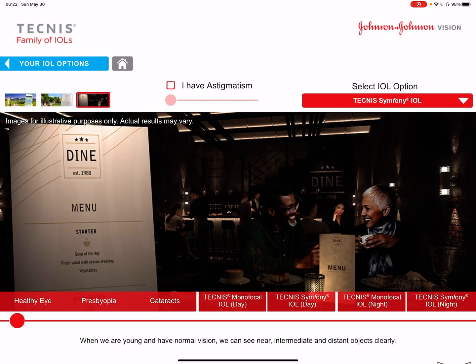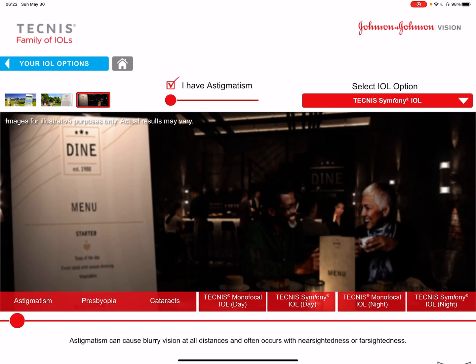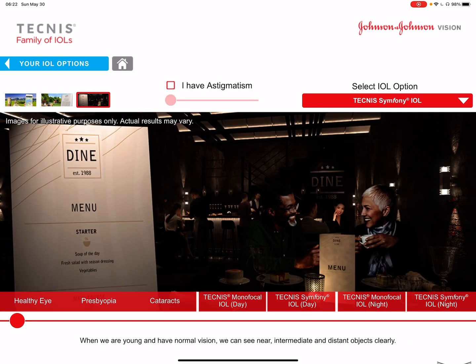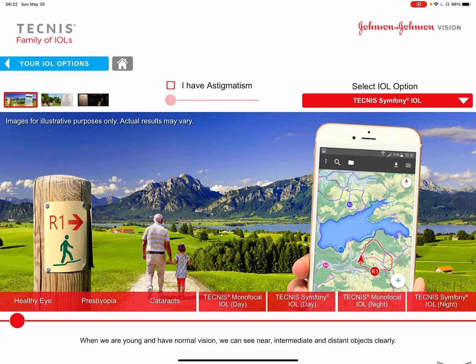Let's go to the vision simulator. On the top you'll find an astigmatism toggle — you can click it on or off. Let's unclick it first. In the bottom you will see the vision. Let's start with the outdoor image, which shows three different distances: there's the mountains in the distance, the grandfather and grandchild at mid-range, the post at intermediate, and the phone up close. A healthy eye will see everything in focus.